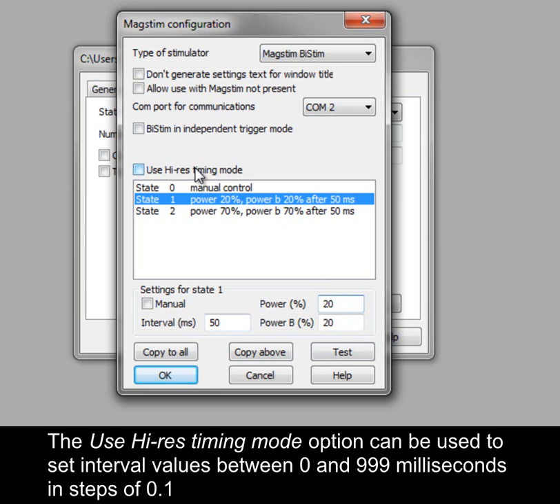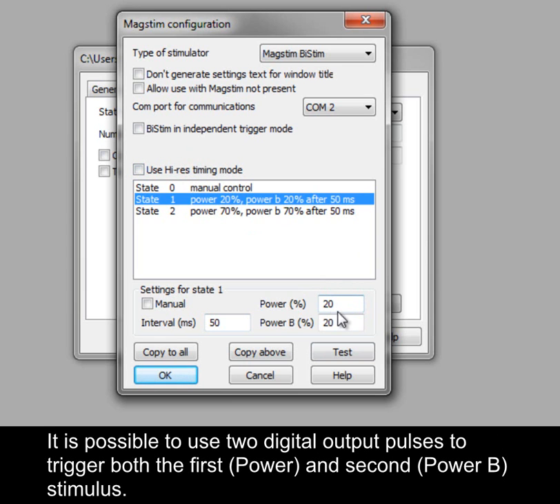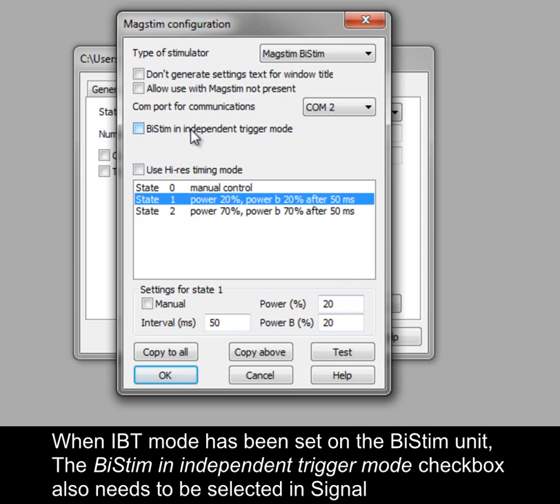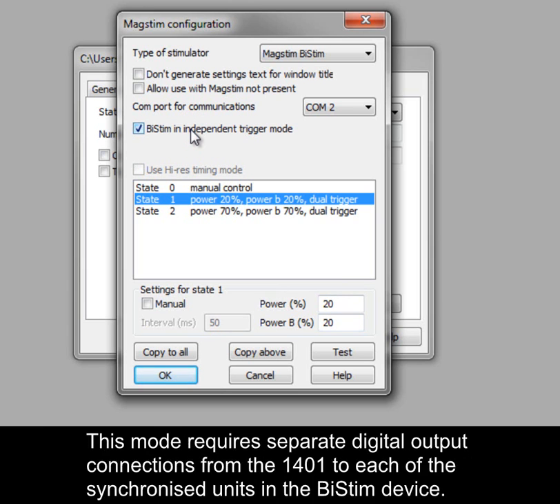The Use High Res Timing Mode option can be used to set interval values between 0 and 999 milliseconds in steps of 0.1 of a millisecond. It is possible to use two digital output pulses to trigger both the first (Power) and second (Power B) stimulus. To use this method, the BiStim unit must be set to use Independent Trigger Mode (IBT mode) — see your BiStim User Manual for details. When IBT mode has been set on the BiStim unit, the BiStim in Independent Trigger Mode checkbox also needs to be selected in Signal. This mode requires separate digital output connections from the 1401 to each of the synchronised units in the BiStim device.